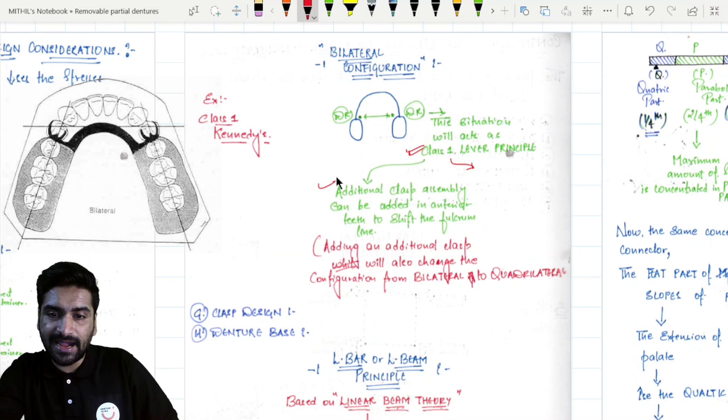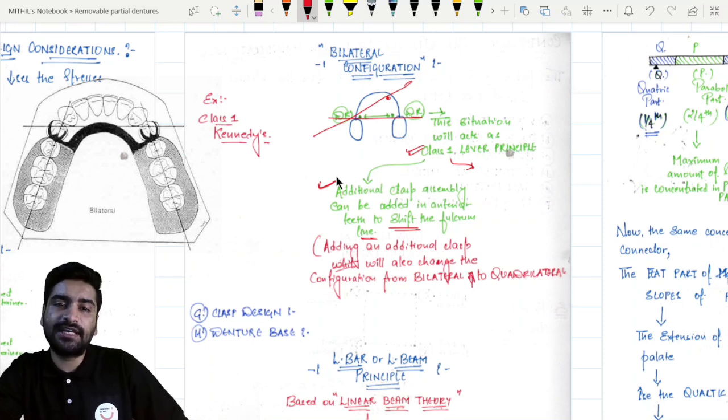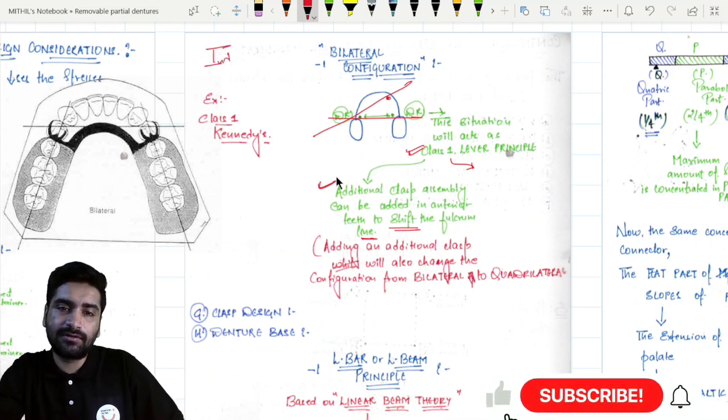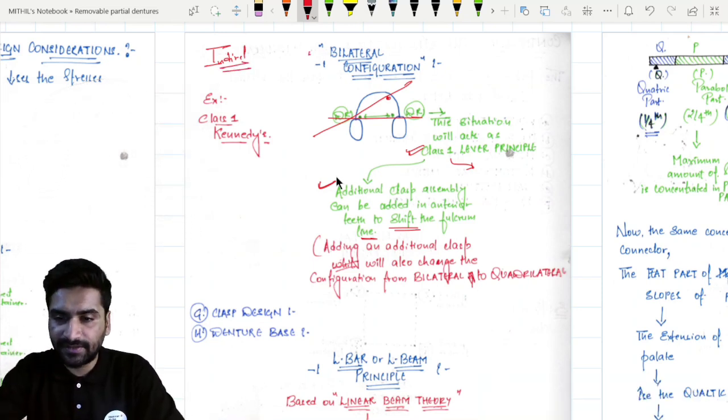So you can add an additional clasp assembly anterior to the teeth and shift the fulcrum line. Suppose here is the fulcrum line. Now if you are adding one more clasp, you are shifting the fulcrum line like this. That you will study better when you are studying about indirect retainers. Right now just understand what is bilateral configuration.